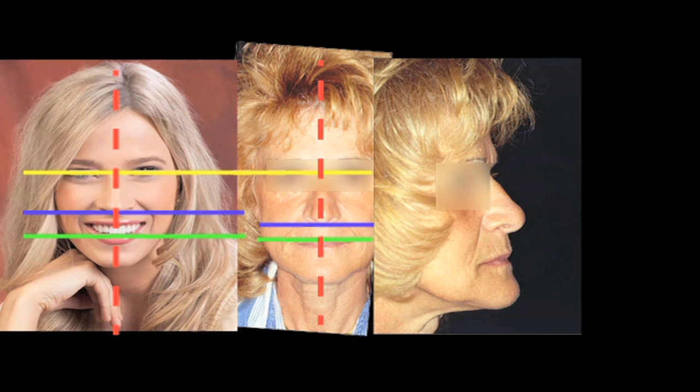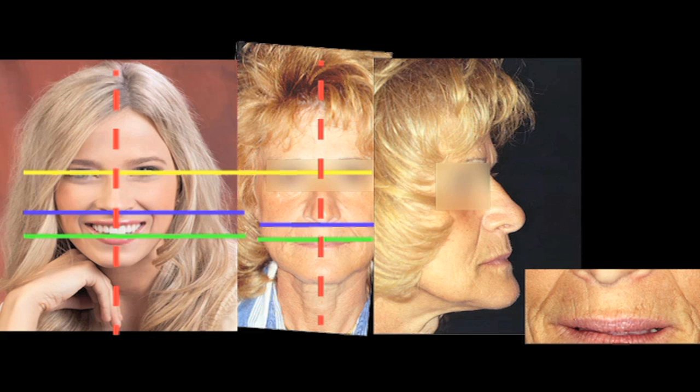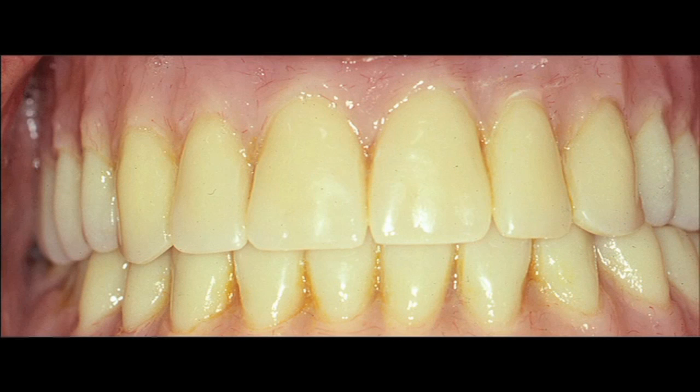And one of the things with that lower third being exacerbated is if we take a closer look, with the closed vertical dimension, you'll notice a significant number of lines or wrinkles, and you would never want to tell a female that her lips look wrinkly, but in this case, this demonstrates a significant deepening with the overclosed vertical of the nasolabial fold, bilateral, along with the wet-dry line of the lower lip being actually inverted. And the reason for this is because when we retract her lips, this is the prosthesis that she has under it.